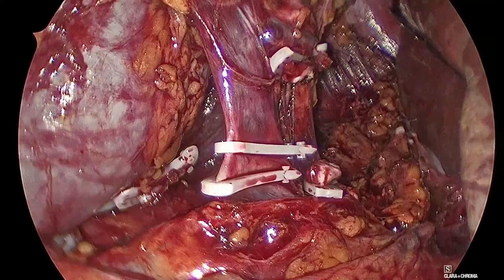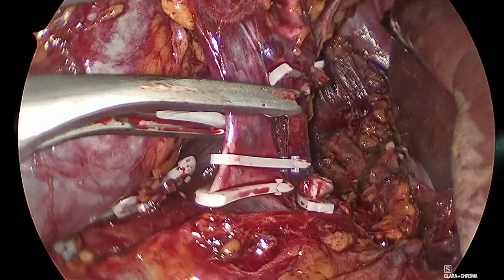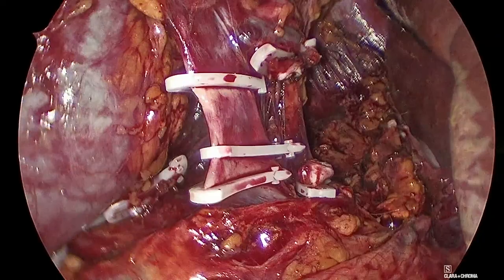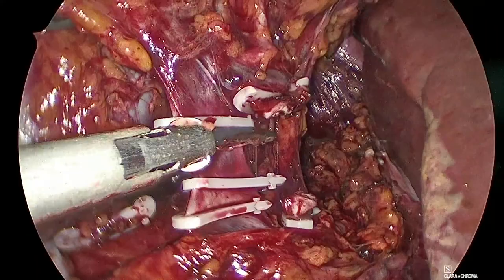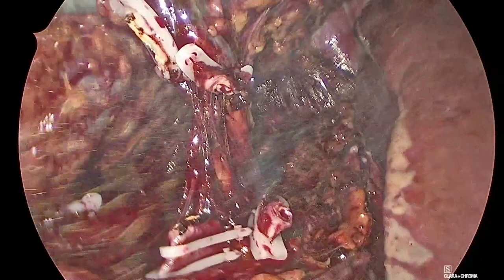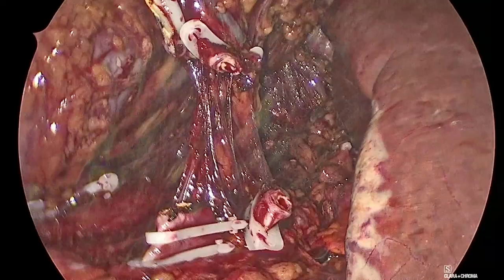See, I always have the same question for people. Give me the platypus, the fenestrated. It's always the same, you know, there are people arguing, yes, you save money if you use Hemoloc, but I would say that had I used the endo GIA, I would have been finished 5 to 10 minutes ago. So in Germany, do you, give me another Hemoloc, please, do you calculate the OR time? Is it something that is important?